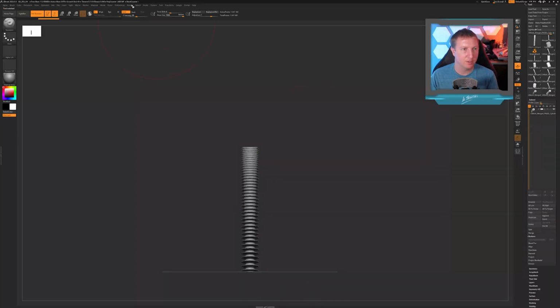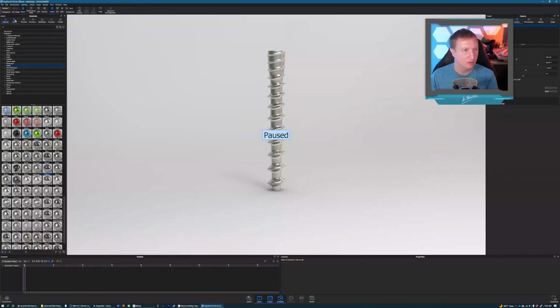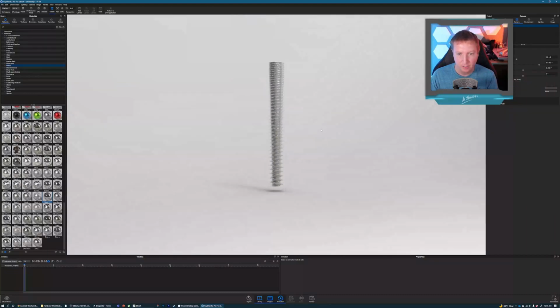All right, so let's go ahead and render this. I'm going to go render, external render, KeyShot. We'll hit the render button, and it should pop up over here. I just need to unpause it. All right, so now we've got our screw here. Let's give it a metallic sheen. I'll just put it as a stainless steel for now. All right, so I think that looks like a pretty good Acutrak screw.